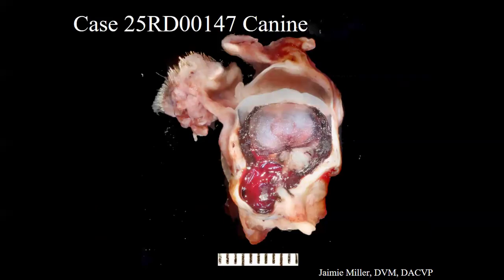So, moving on. Next up, we've got the right eye from a 6-year-old Yorkshire Terrier mix. Female, intact. She originally presented early December of last year. There was 3+ flare, fibrin, and hyphema, along with orbital swelling causing exophthalmos. And then about a month later, in January of this year, the exophthalmos had resolved. There was still 2+ flare and fibrin.